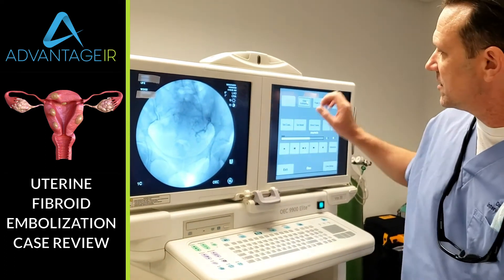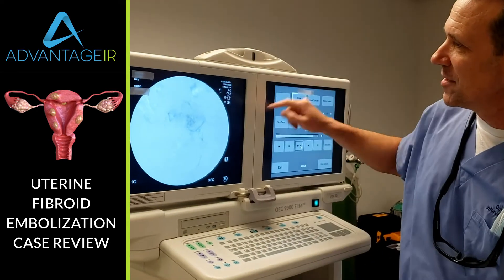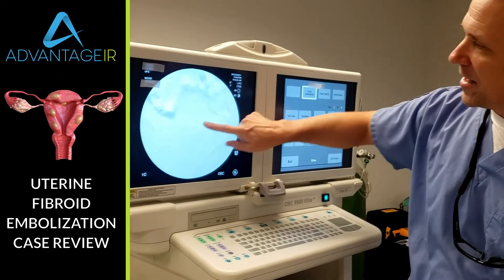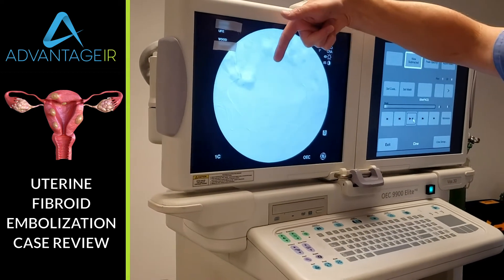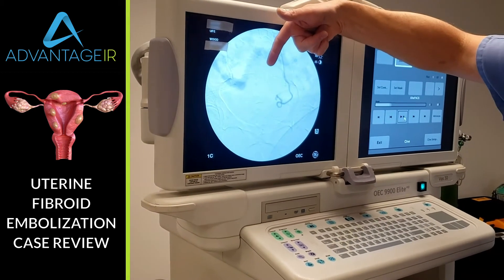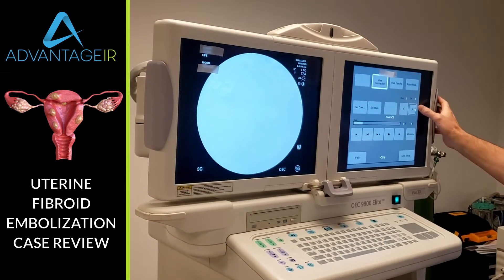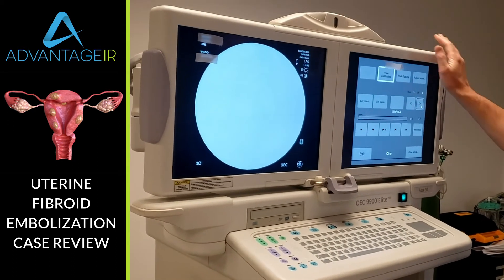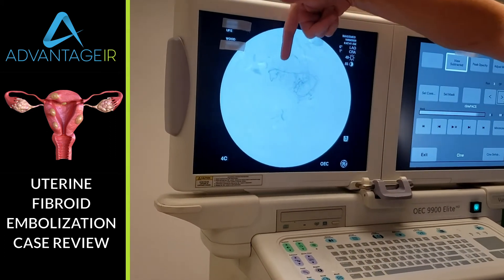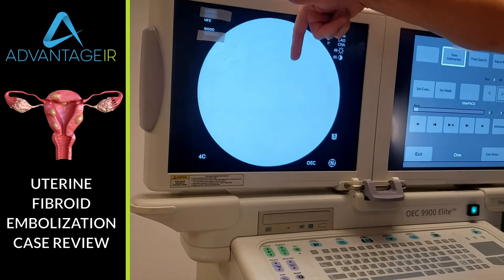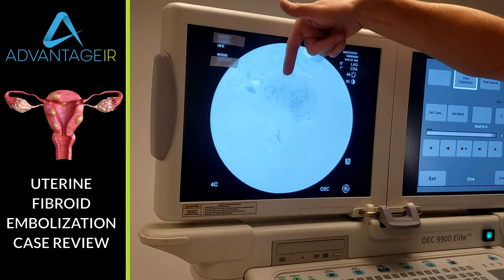We can see fibroid tissue being perfused by the arteries as we extend out these angiograms and watch as that contrast dye perfuses the fibroid tissue up here. On this angiogram, we've gone deeper into the uterine artery, and we're injecting and we see contrast dye perfusing through the tissue of the fibroid up here.